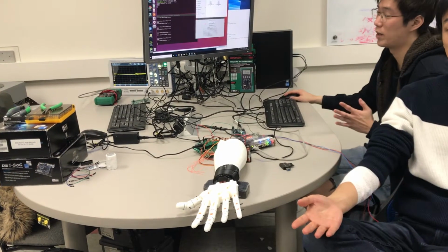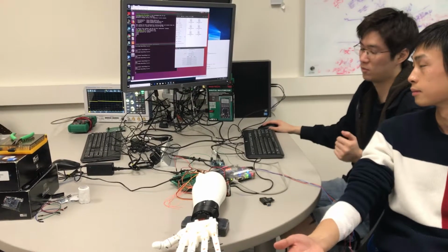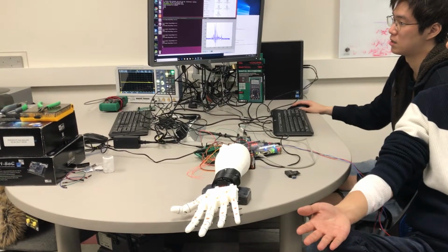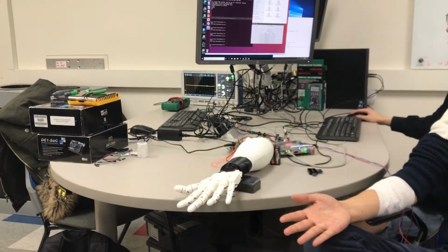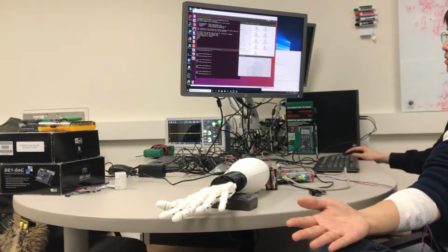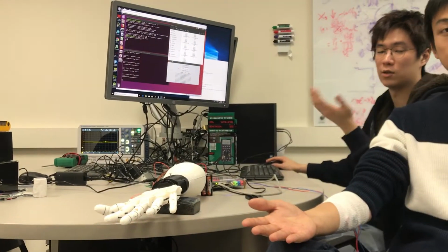And in a similar way, we're going to train gesture number 2, which is going to be just a 1 movement of a finger. The last gesture we're going to train is the wrist movement.